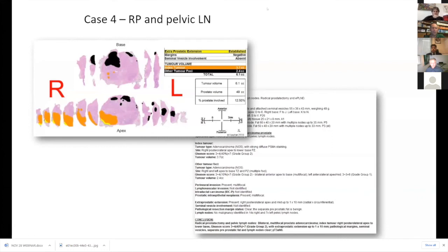But in terms of location generally, it really is fantastic, which is why our MDTs have become so useful in terms of providing this feedback. And then, of course, using the MRI Pro program as well to provide that instant feedback for learning has just been invaluable, at least we found in our MDTs.